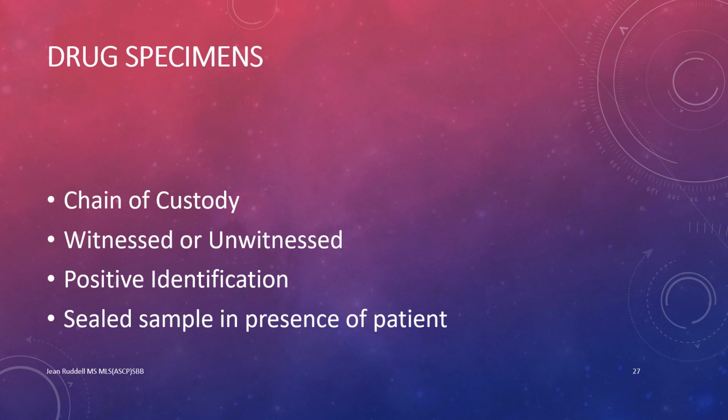Urine specimen collections may be witnessed or unwitnessed. The decision to obtain a witness collection is indicated when it is suspected that the donor may alter or substitute the specimen, or it is the policy of the client ordering the test. If a witnessed specimen collection is ordered, a same-gender collector will observe the collection of 30 to 45 milliliters of urine. Witnessed and unwitnessed collection should be immediately handed to the collector. If the urine temperature is not at body temperature, or if the sample is an unusual color, it may indicate tampering.